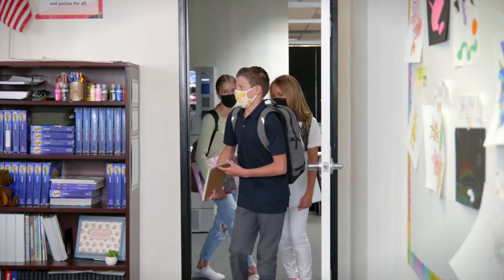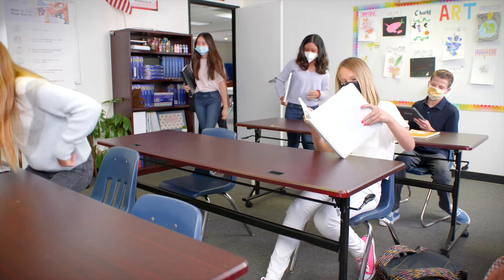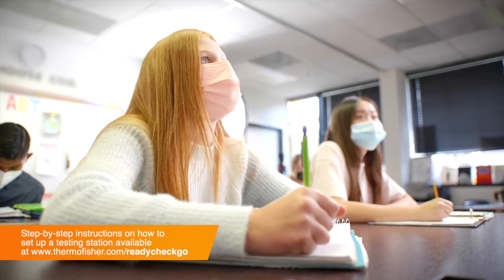In-person coronavirus testing may seem complicated, but it's actually a quick and easy process that participants and administrators can perform simply. Once your testing station is set up, participants can begin the testing process.